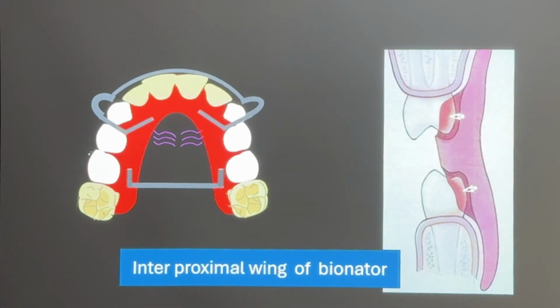So now once again I will explain about the upper wing. Always the upper wing needs to touch the teeth. But sometimes it's too tight in the mouth. At that time, as I already told you, you need to make some little space in the major part of the wing.